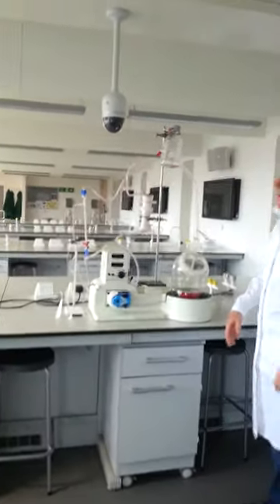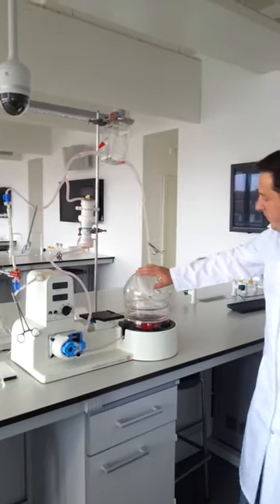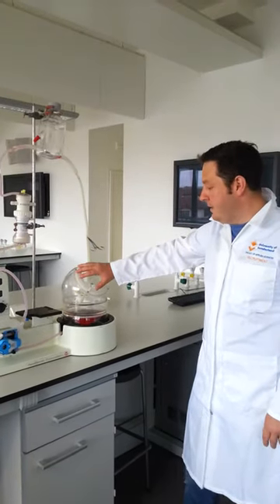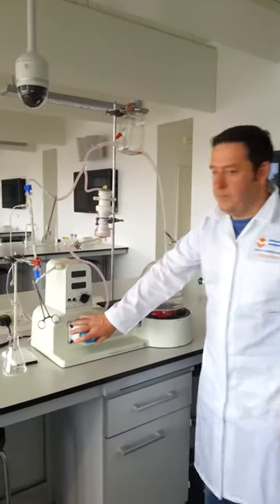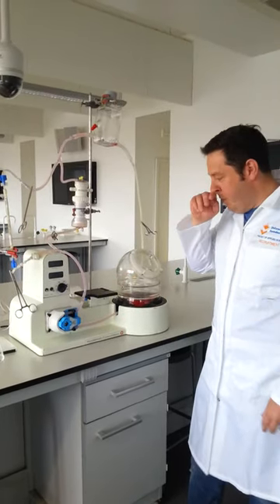This is our heart circulation system. We have a ball here that the heart will be placed in. This is basically a pump that helps assist the heart in pumping.